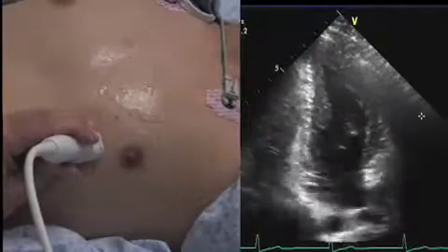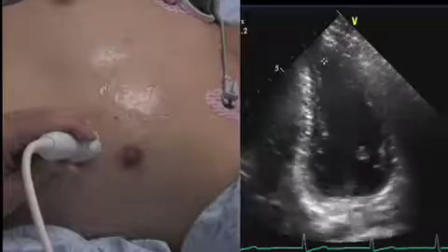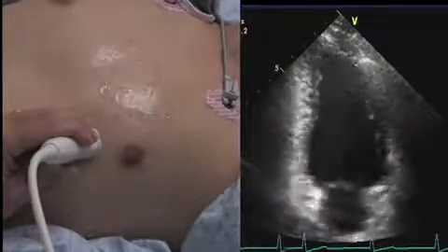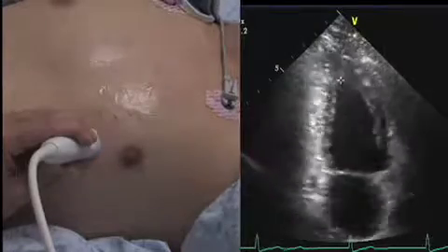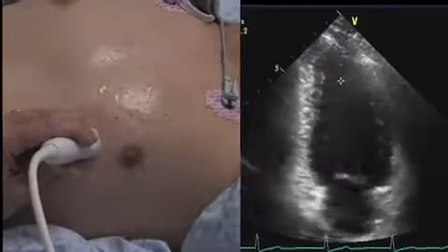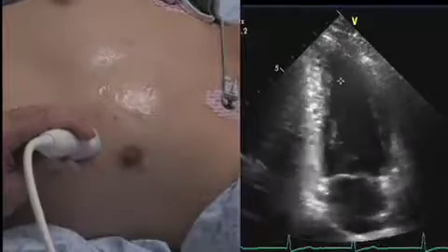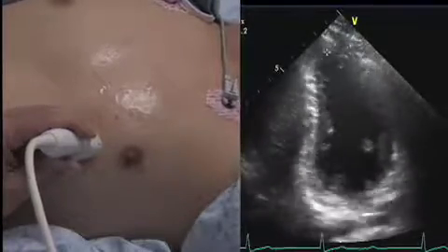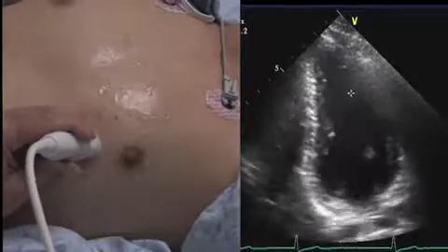Let's look at the apex here. This is a nice shot of the apex pinching off. If I adjust just ever so slightly, look at the apex now — it is actually squeezing in like it would in a short axis view. That means I'm foreshortening my apical view. So you need to make sure you've got that opened up all the way in every apical view. You want to see it more pinching than just squeezing in.